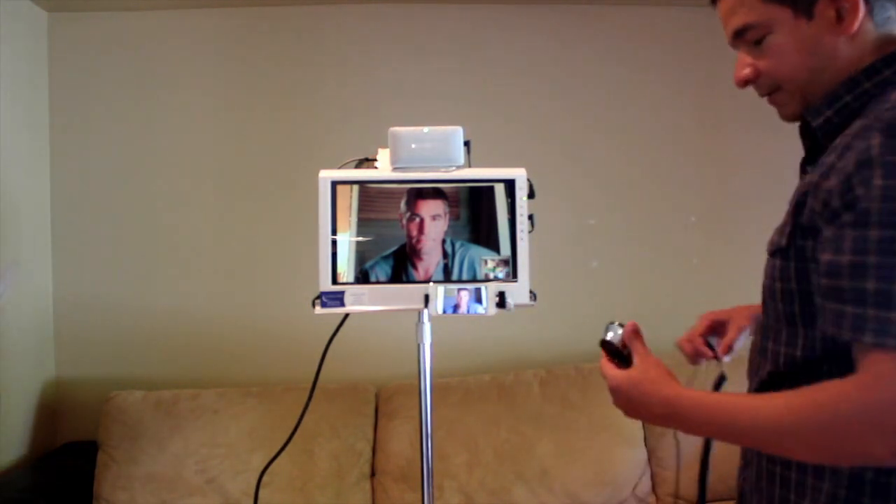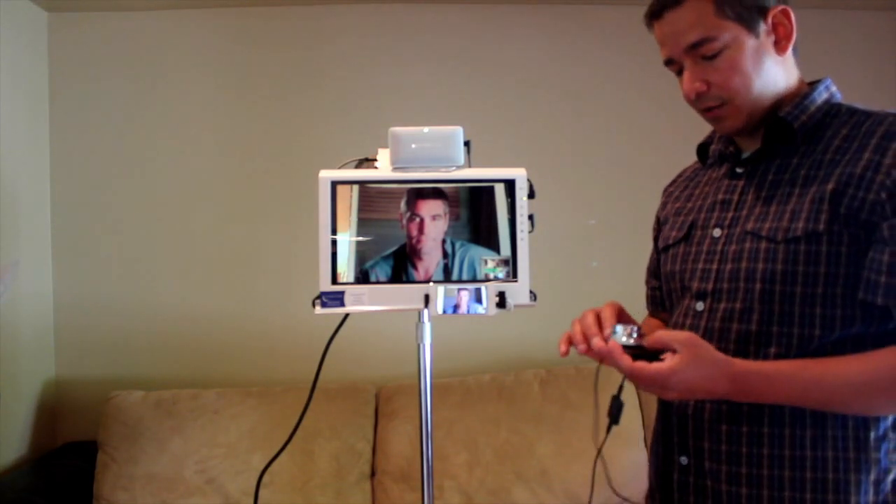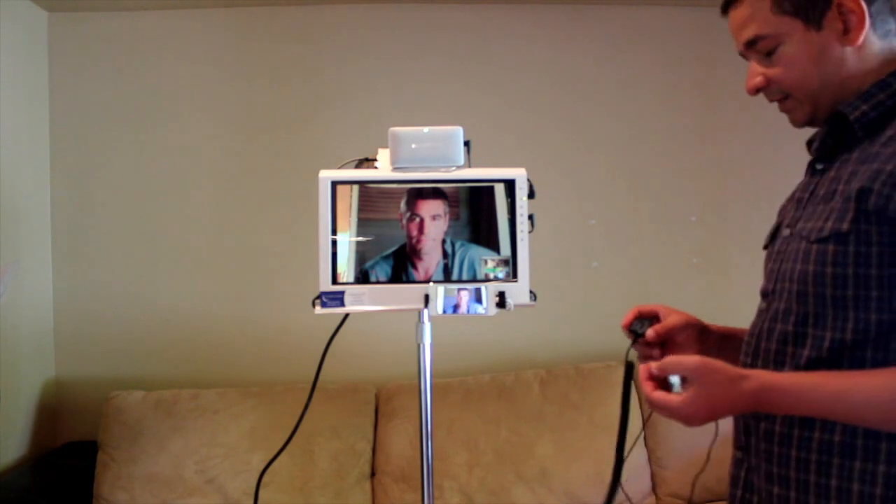The digital stethoscope we use is a powerful tool. However, I'd like to go over some of the features so that you feel comfortable with utilizing it.